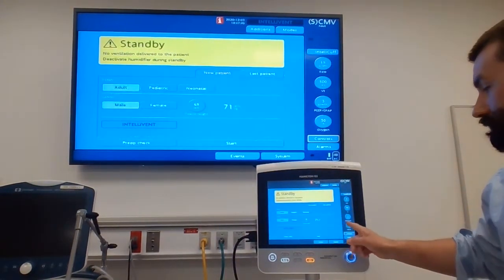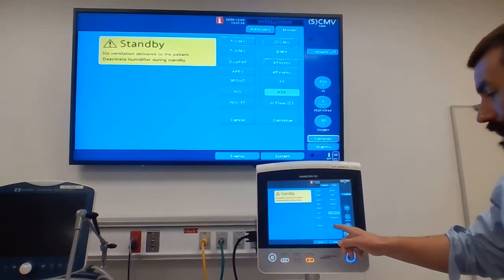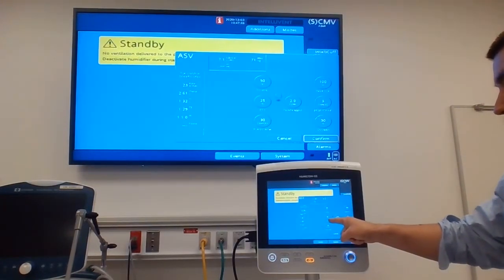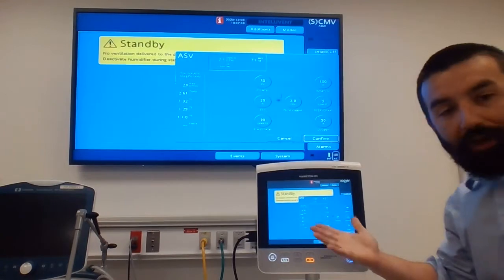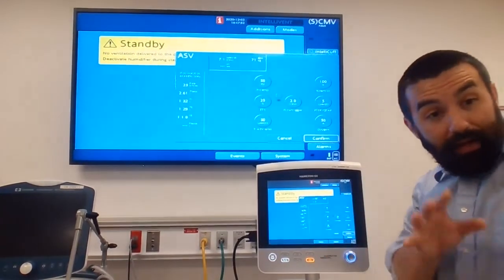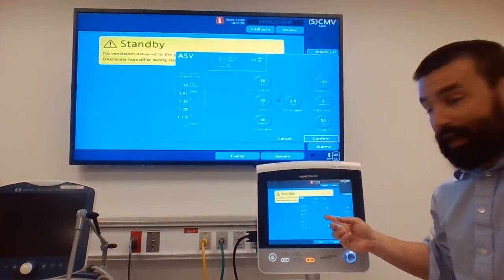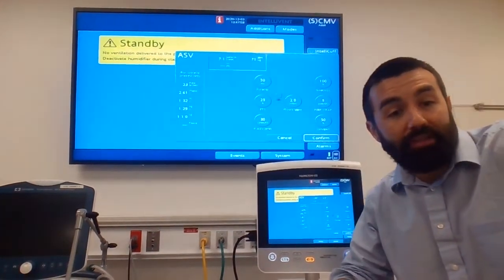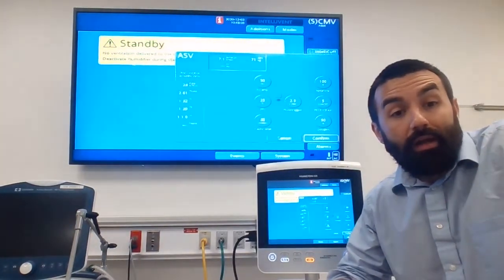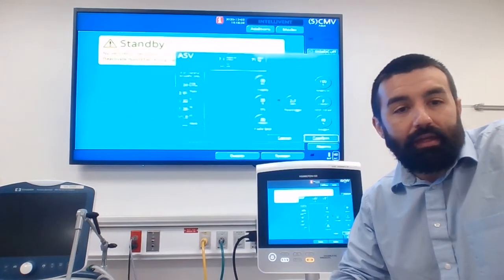Okay. So we're setting that at 30 here. We have expiratory trigger sensitivity, or flow cycle percentage is what we'll kind of refer to it as. So that's going to be for spontaneous breaths, and we'll talk about how these breaths are going to manifest. And then we got rise time. Rise time would be for the patient's spontaneous breaths as well as the patient's mandatory breaths as well.